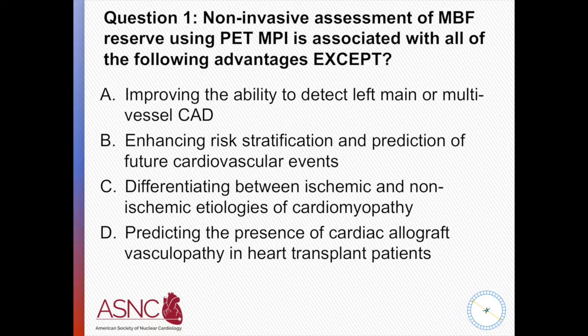Okay. You want to talk about D? There's also mounting evidence that PET can be very useful in management of heart transplant patients with suspected allograft vasculopathy.